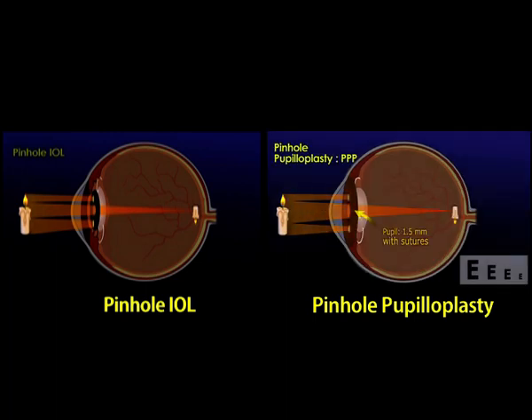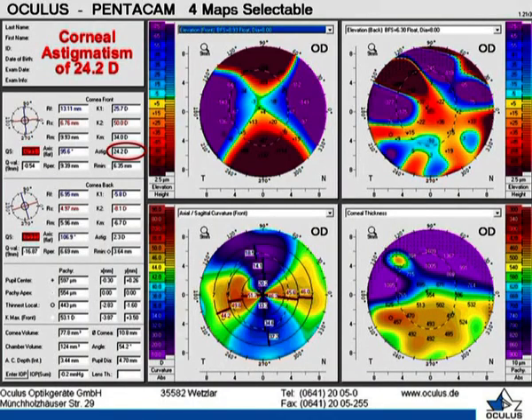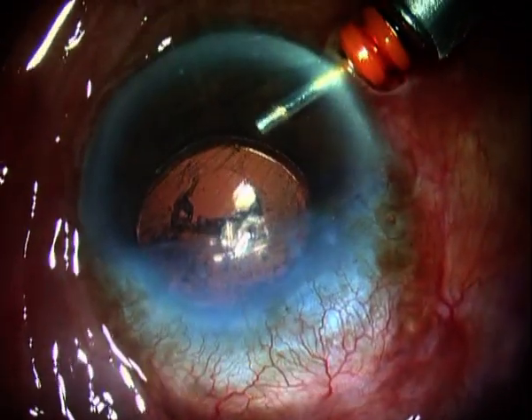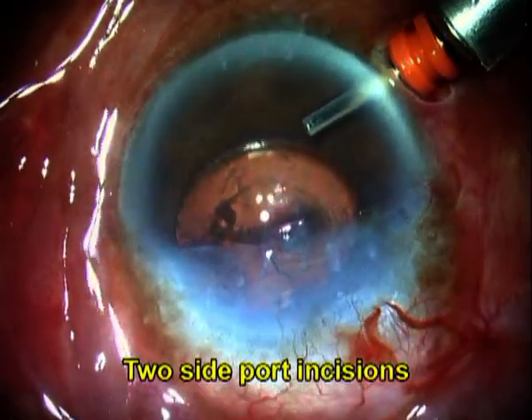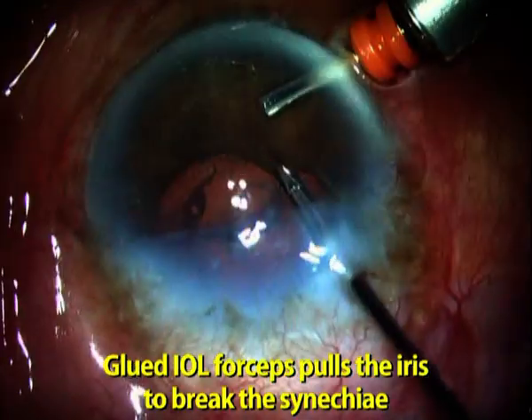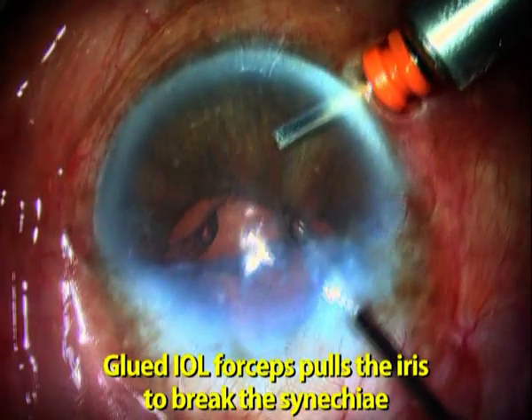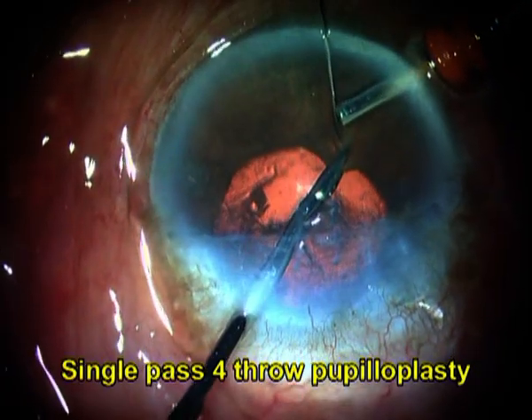A patient had a patch graft done for a small incision cataract surgery, SICS, landing with high astigmatism of 20 diopters on the Pentacam. A trocar AC maintainer was fixed, 2 side port incisions made, and a single pass 4-throw pupilloplasty planned. The synechiae were broken between the iris and the peripheral cornea.